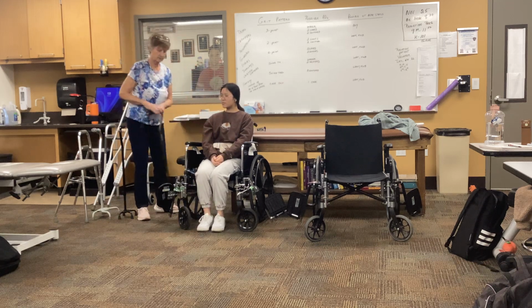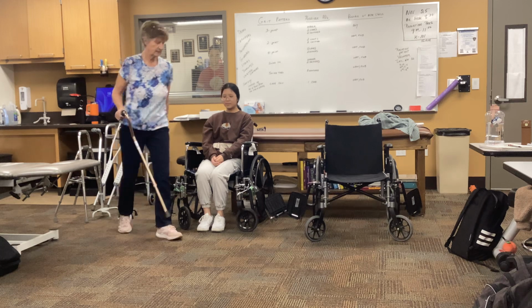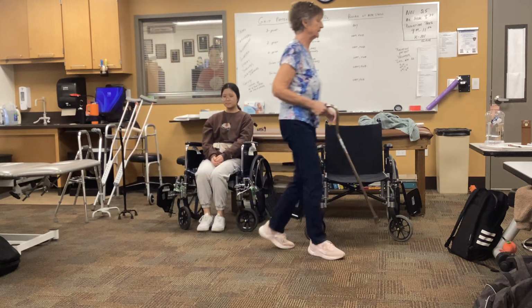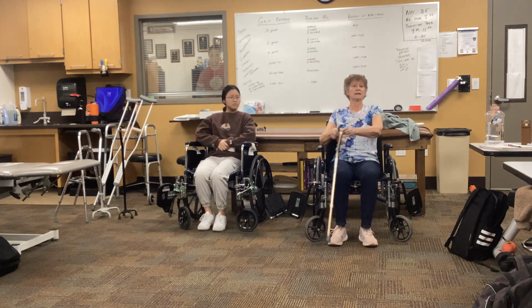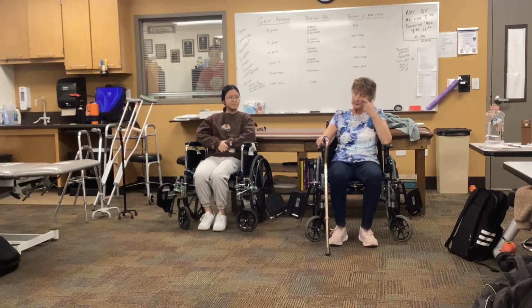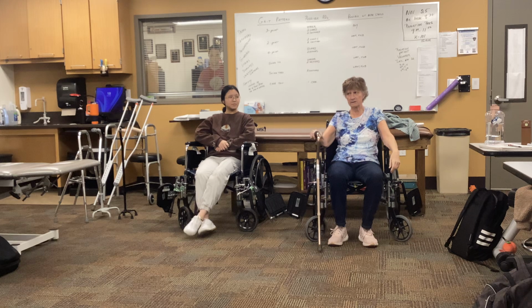Okay. So we'll start with the single point cane. Now we only have one device. Which side does it go on? The good side or the bad side? Olivia, what do you think? If you read the chapter, it's in the chapter. Emmanuel? Go on that side.